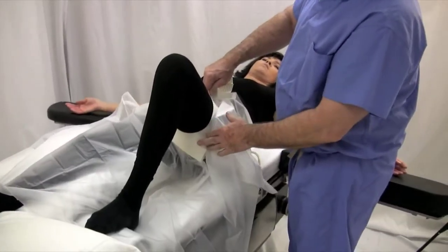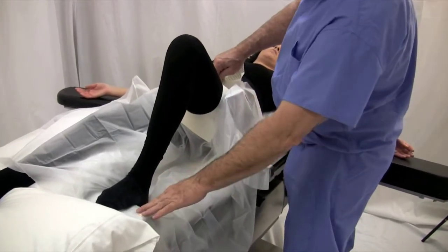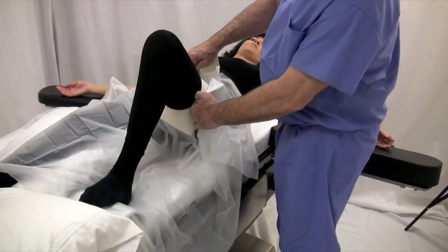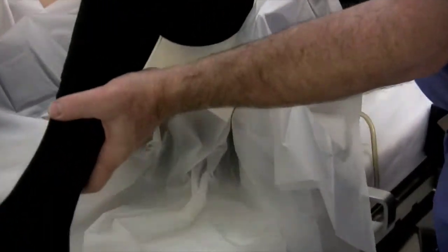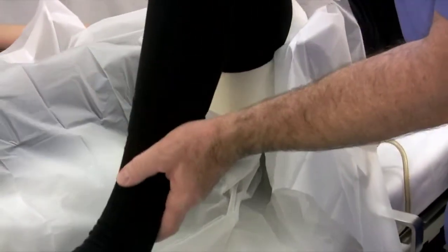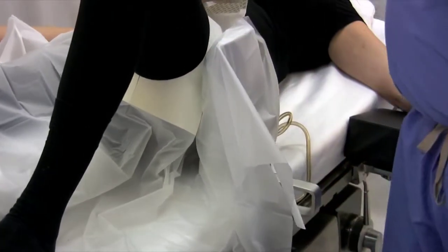I always place a sticky u-drape to protect the devices and the tourniquet, and I push the drape between the thigh and the lateral support so that when you move the patient's leg, there's no abrading between the tourniquet and the lateral support.